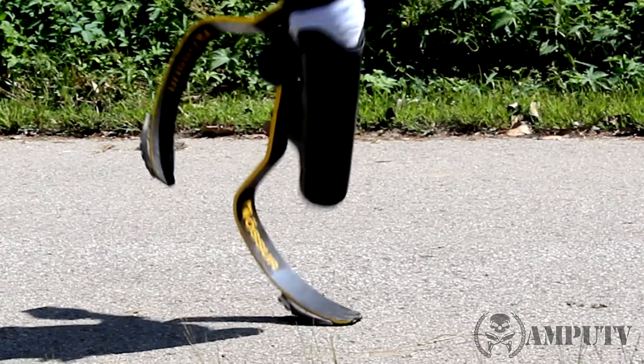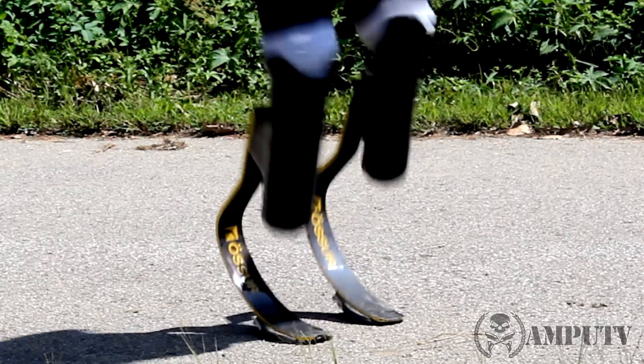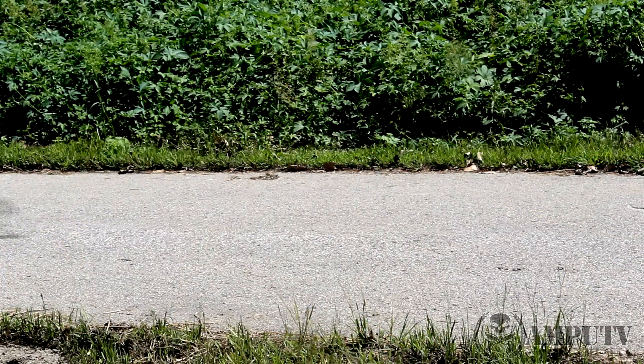This compression helps because whenever you step down, it stores a lot of your energy. Then whenever you go to lift your foot when you're running, it releases all that energy just like a spring would. As you can see, whenever I step down, all the energy stores up in the blade, compresses, and then when I go to push off, it releases like a spring.